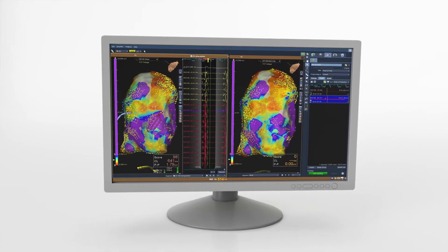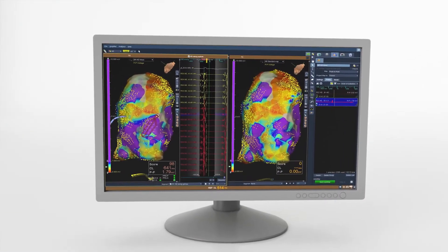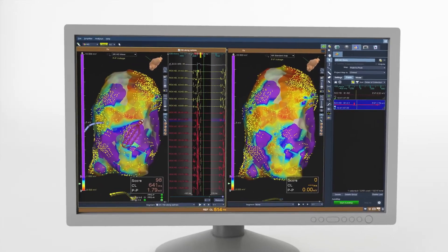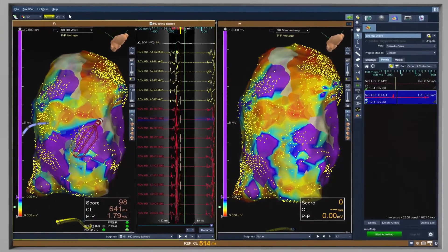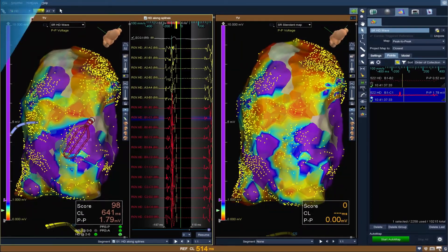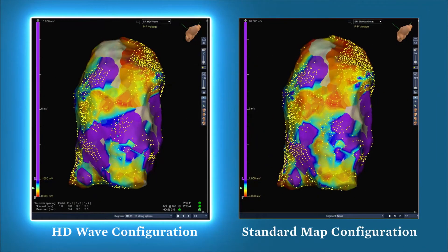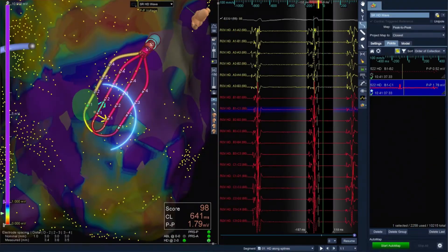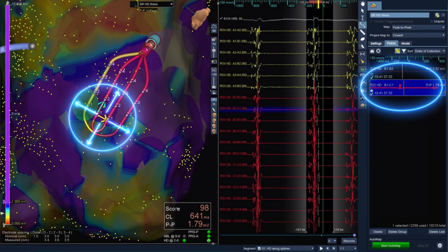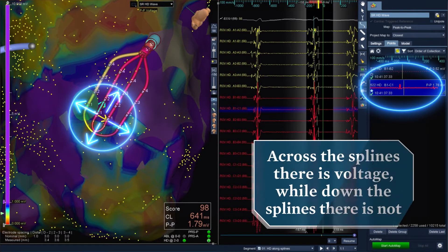When the Advisor HD Grid Mapping Catheter, Sensor Enabled, is used in conjunction with the EnSite Precision Cardiac Mapping System, the highest amplitude data is collected and displayed on the map to better identify areas of scar. With HD wave technology, the new grid configuration captures data in both directions compared to standard linear mapping — across the splines there is voltage, while down the splines there is not.